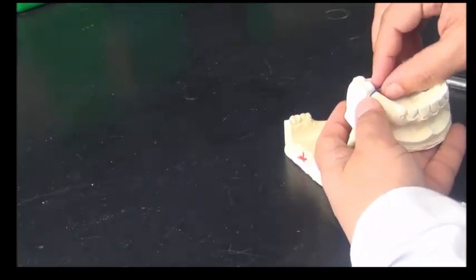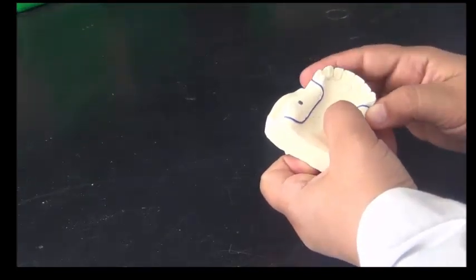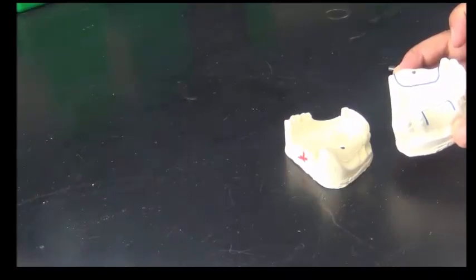On the bounded saddle, I'm going to fill in proximal, palatal, and then on the other side, the other proximal, and once more squeeze it into place using finger pressure. What happens is that this wax has now filled in the space between the angle of the wax and the cast.